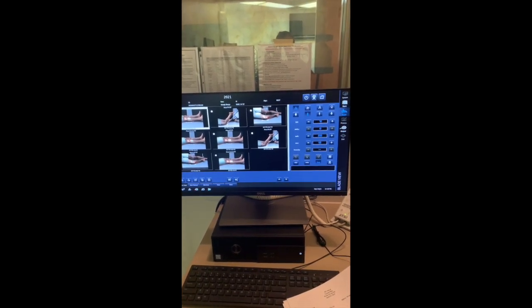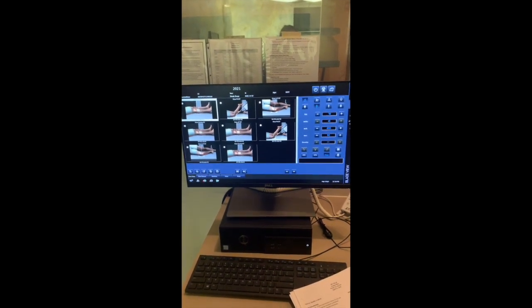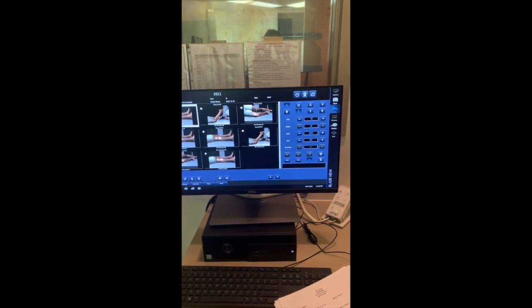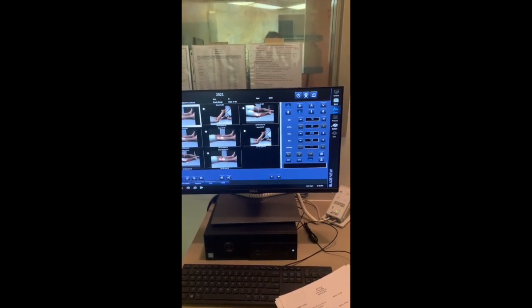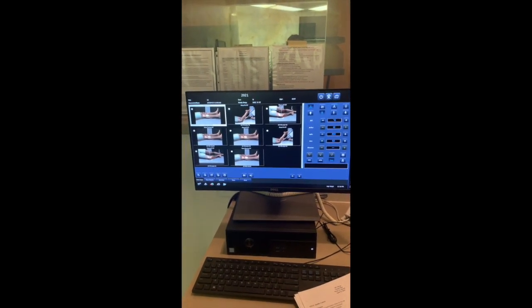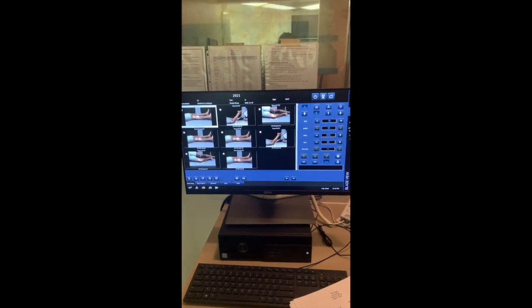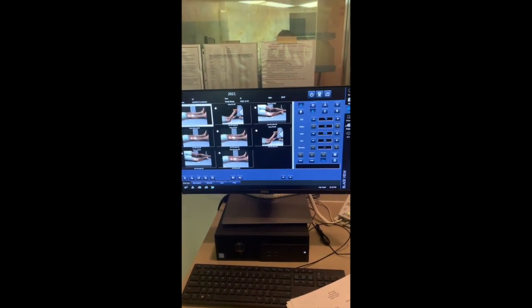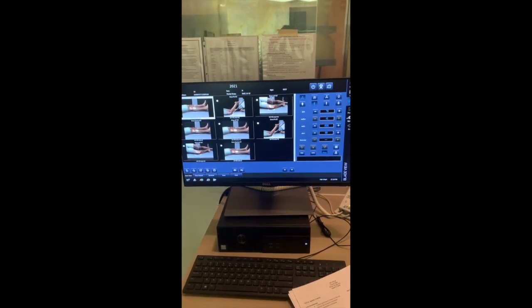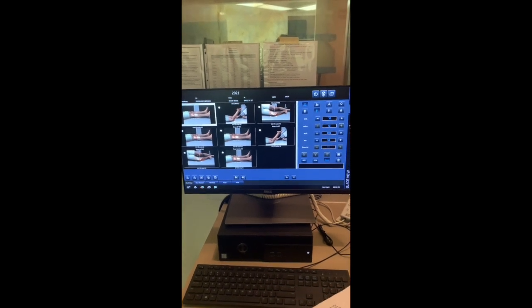So we're gonna look at exposure index numbers as we do this. For this one, you're gonna do 70 kVp, 10 mAs, 200 mA station, 50 milliseconds, large focal spot, and then you're gonna expose it. We're gonna look at the EXI number. Then we're gonna take a second one, completely change all the numbers, every single one of them, and expose again. And then we're gonna go right back to our very first one of 70 kVp, 10 mAs, 200 mA station, and 50 milliseconds. So let's see how this works.